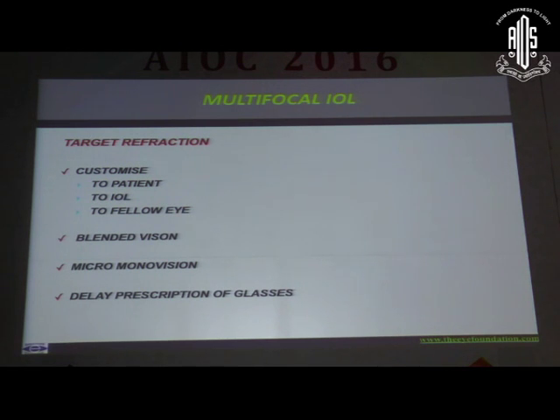If it's a 4 diopter add intraocular lens like the original Technis lens, which translates to 3.2 diopters for near, then obviously I am not going to increase the amount of basic power that I am putting in the patient. I do not want to steal some amount of near vision in that patient. But if it is a 2.5 diopter add, I would err more on the side of bumping up the power. I hope you understand. If it's a 21 and I'm putting a 2.5 diopter add, I'm more inclined to put a 21.5 rather than decrease it to 20.5. And it is vice versa when I'm having a 4 diopter add.